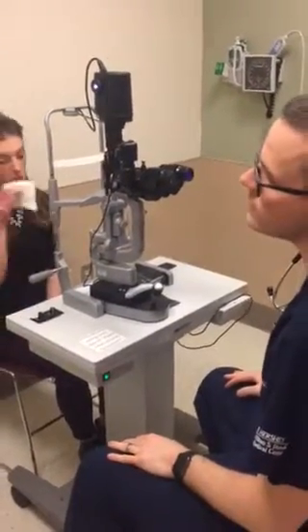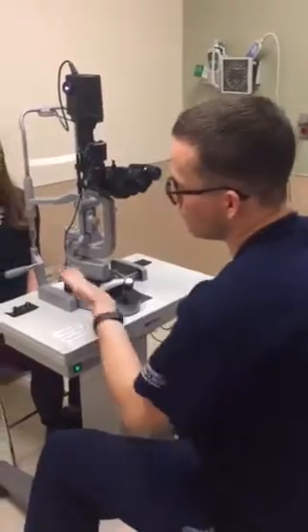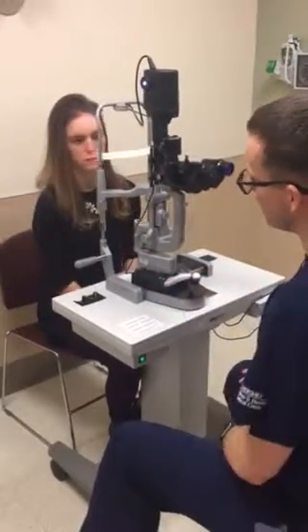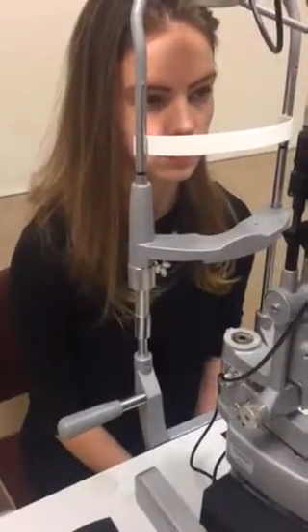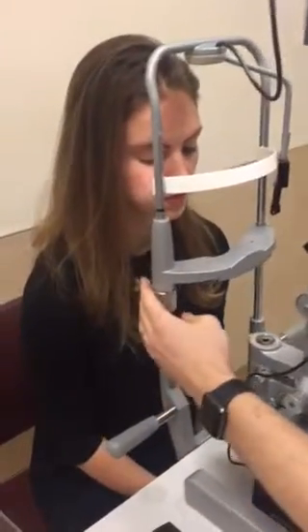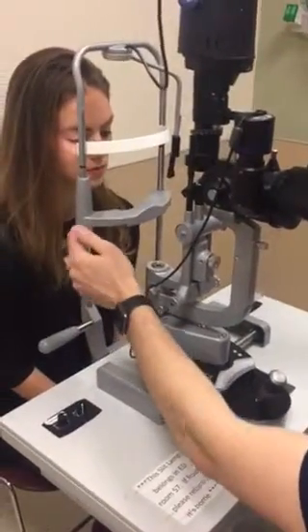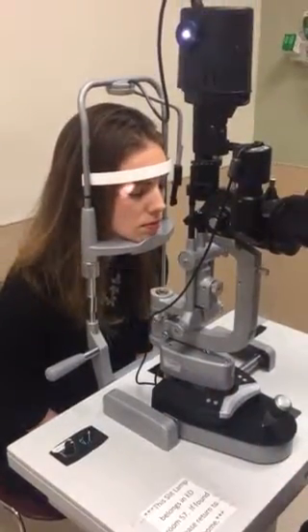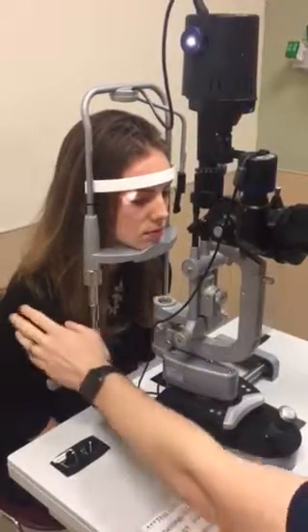Positioning is one of the most important things with the slit lamp exam. For a patient like this, they'll need to scoot forward on the chair. The goal is to get the black mark at the lateral canthus. You have the headband, the chin rest, and the chin height adjustment here, plus a lever down here which controls the height of the slit lamp. Bring the slit lamp up, then lower the chin rest a bit. Tell the patient: 'Come forward, put your chin in the cup and your head against the white bar.' That looks pretty good — the height mark is right at the lateral canthus, giving you a good starting point.